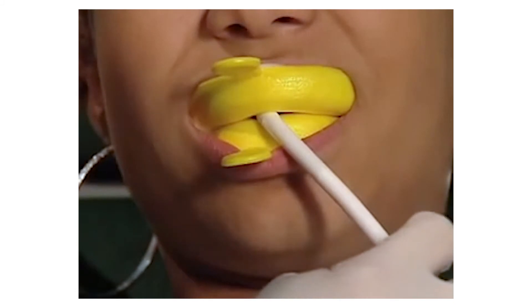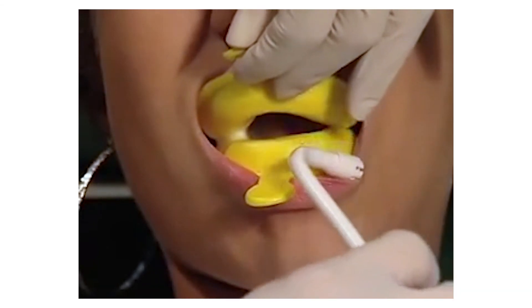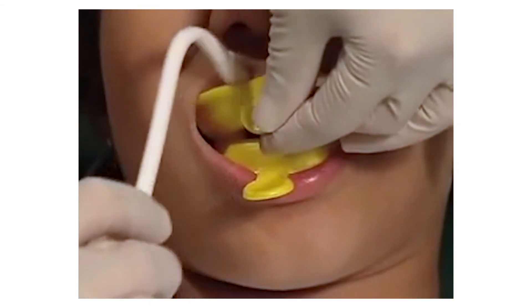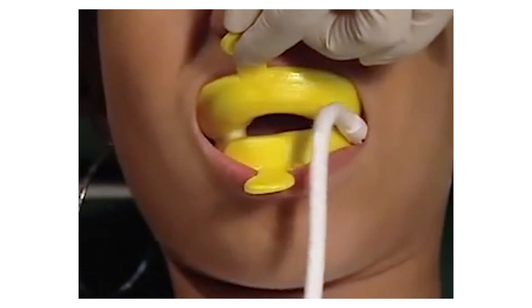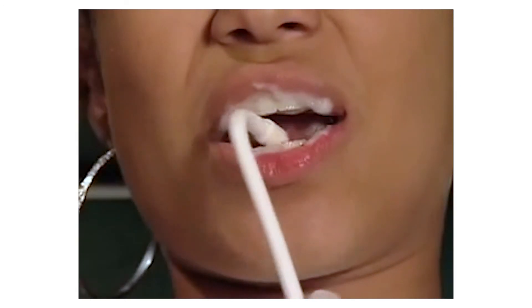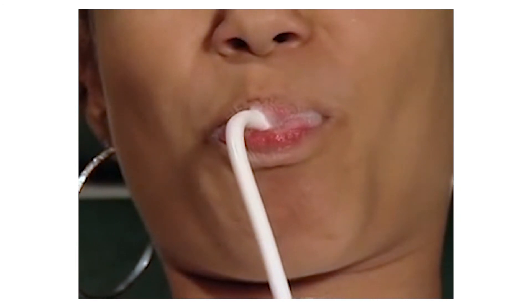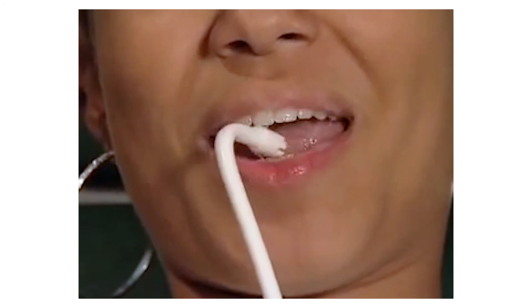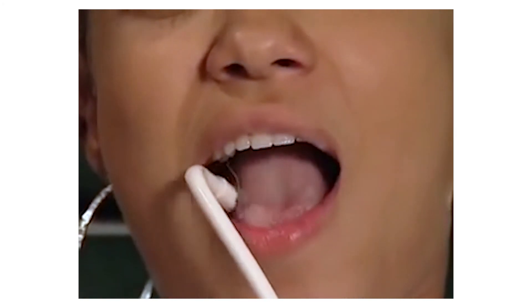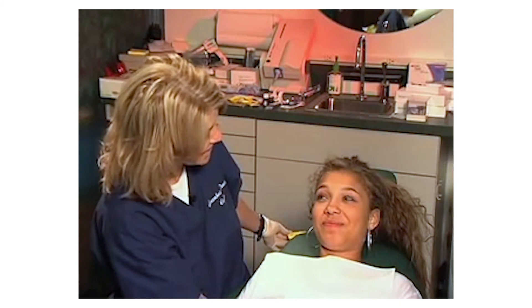Okay, it's been about 60 seconds. Haley, open for me — I'm just going to suction all this away. I want to make sure when I pull it out that it doesn't go everywhere. We love this because it really does stick in the tray, so we'll take that right out. Haley, close your lips over that like a straw and close down. How was the flavor? You like it? There you go — you heard from Haley, she likes the cotton candy!